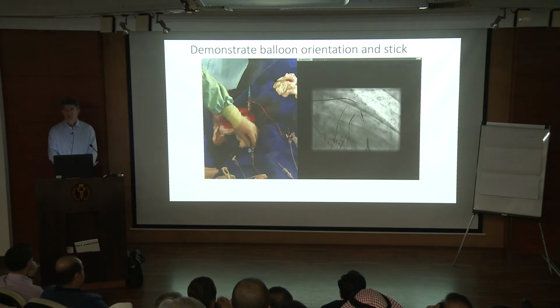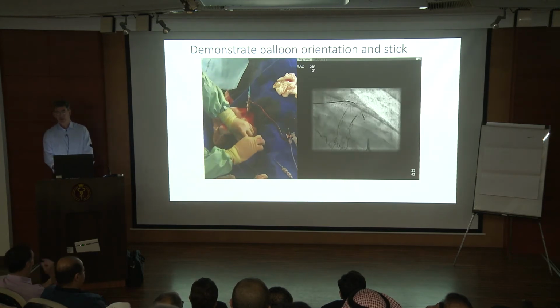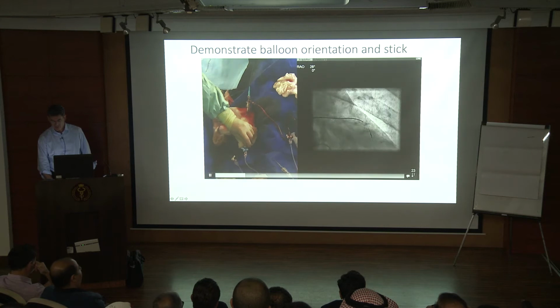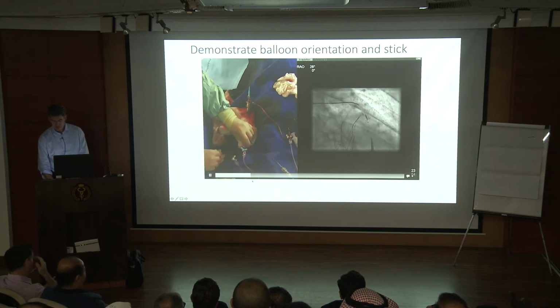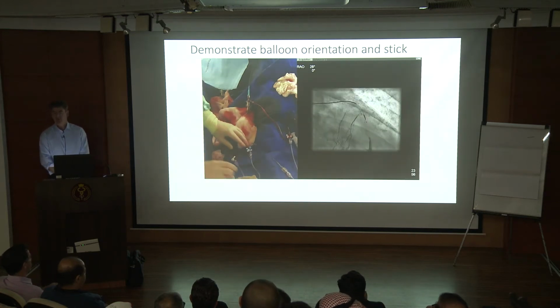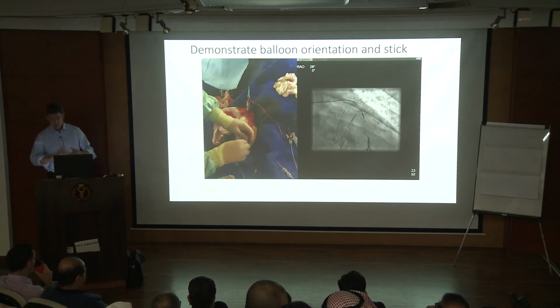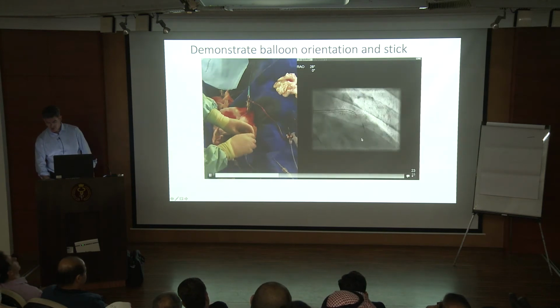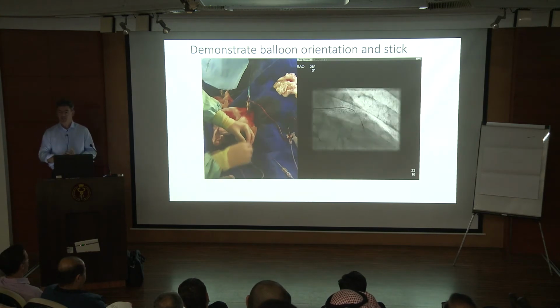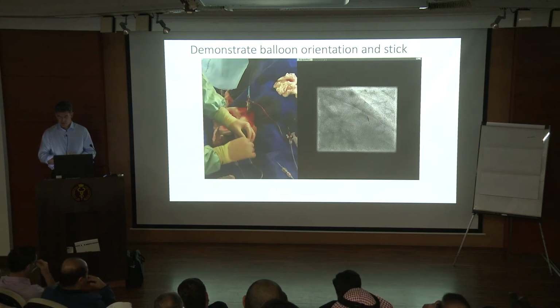We also saw this yesterday, the very nice profile view of the Stingray balloon. You have to be careful about the preparation of the Stingray balloon. Here we see it very nicely in profile. Once that's all in position, this is now getting ready for the initial puncture. Balloon in position, you can see your distal target. There has been some shrinkage here of the target, so it's not a huge target, but the balloon is adjacent to the vessel, and so the Stingray wire is now being introduced.